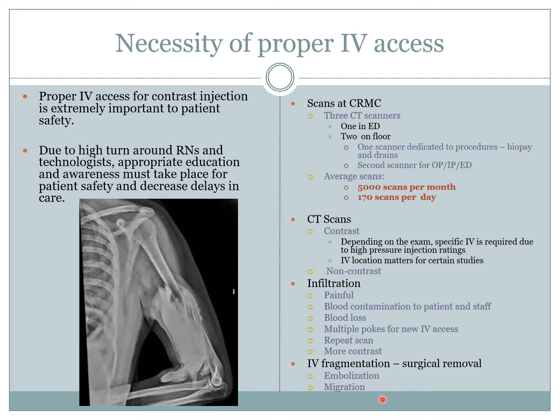That means when a fragment of the catheter of the IV gets lodged into the veins and goes into the person's body. And of course it causes embolization, and it can migrate to other parts of the body that we don't want it to.